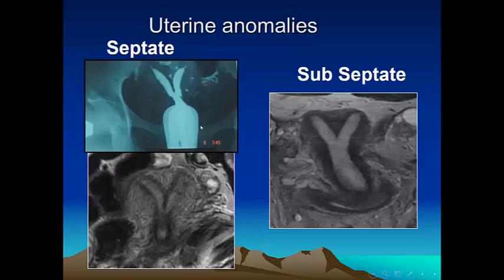Septate: from long ago we used to say that if it is an acute angle, then it is septate, but it is not always like so. So again, from hysterosalpingiography, we don't say septate, we just say duplicated cavity for assessment by 3D ultrasound or MRI.